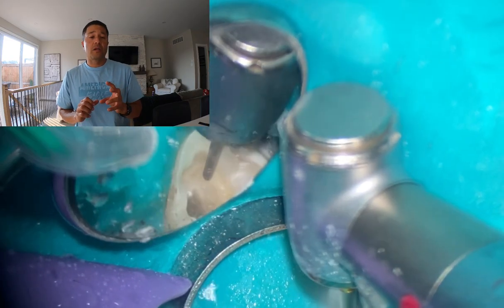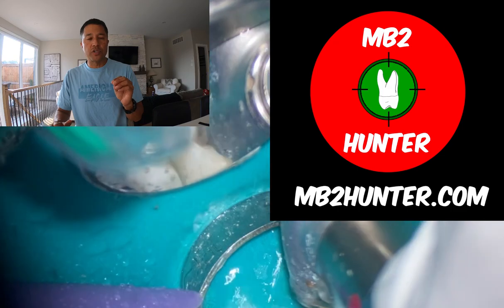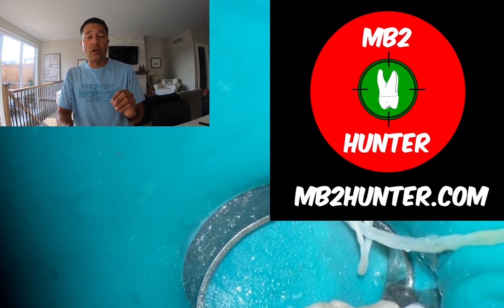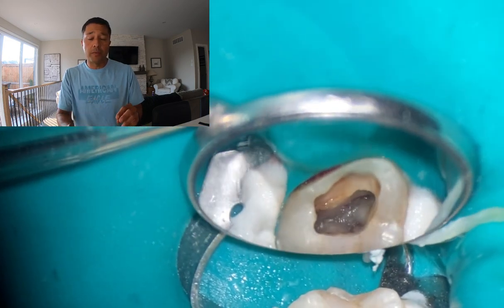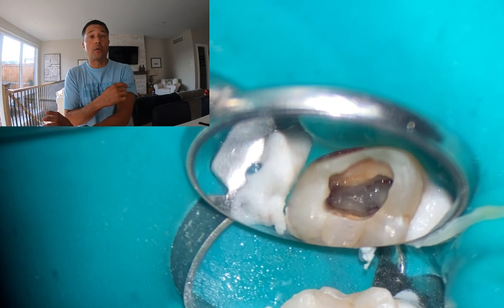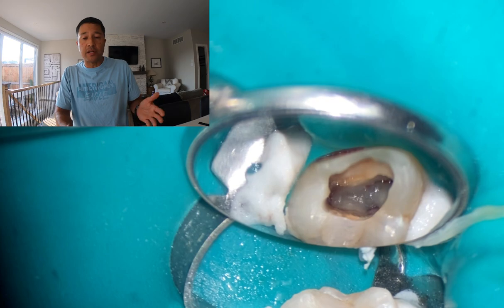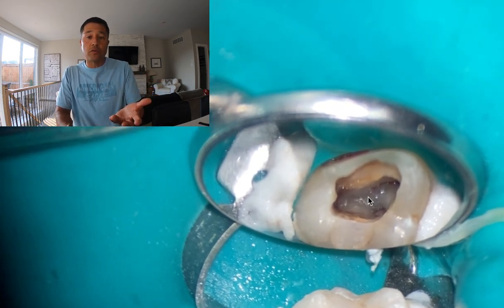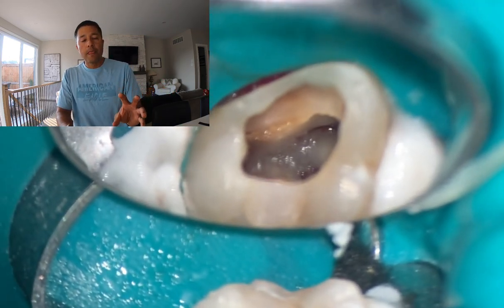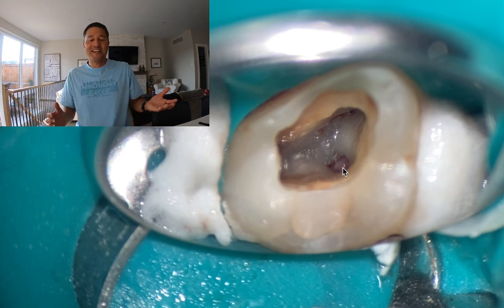If you're two hours into this appointment and the patient's starting to get tired, you can actually stop the procedure at this point — this is essentially a pulpotomy. Because there were already files put down the mesial buccal canal, I don't know if we could leave this as vital pulp therapy since the pulp had already been irritated. But you could argue that, had you not put files down there, depending on the diagnosis, you could have placed some bioceramic on top of the pulp stumps and left it. In all the vital pulp therapies I intend to do there's always one orifice bleeding — and of course, I go to do just a pulpectomy and none of these are bleeding. This would be the ideal one. So there's the coronal portion of the distal buccal — there's our distal buccal. Look how easy that was.